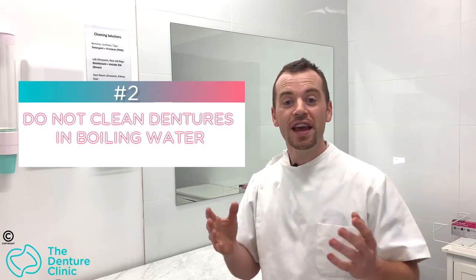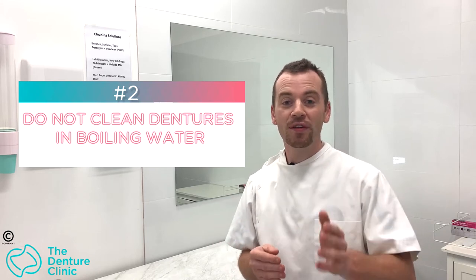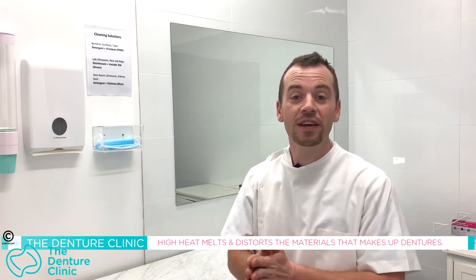Tip number two: things you should never do to your dentures is clean them in boiling water. I know it sounds crazy, but I've actually seen several people do this over the years. Yes, boiling will generally kill off bacteria and give things a clean, but with dentures it actually has a huge impact — it distorts the denture. You boil it, it comes out of the water warped and distorted, and basically the denture is now useless.